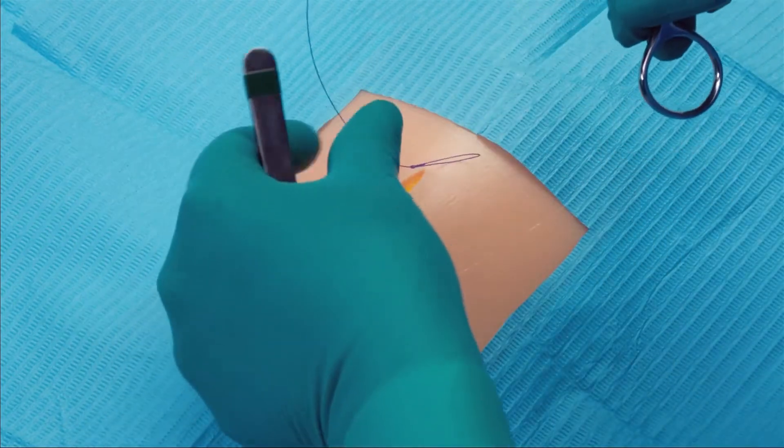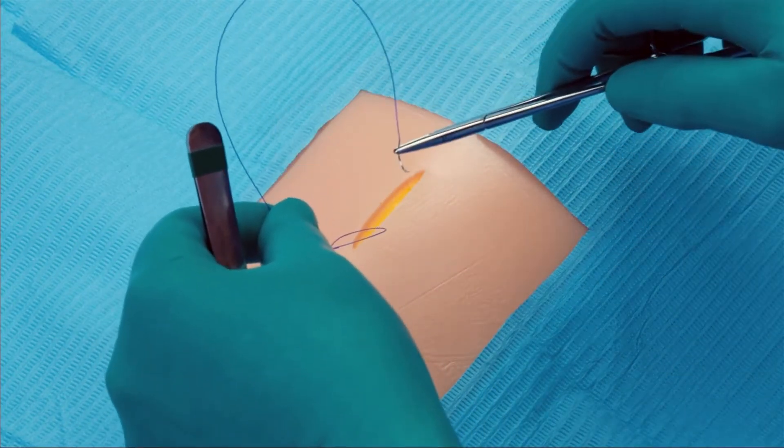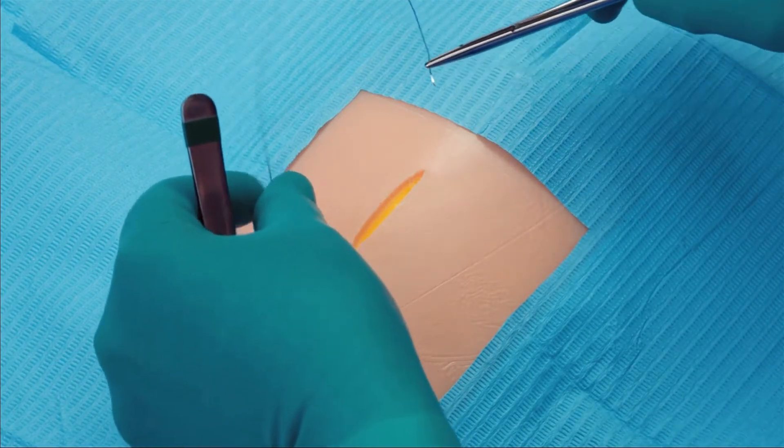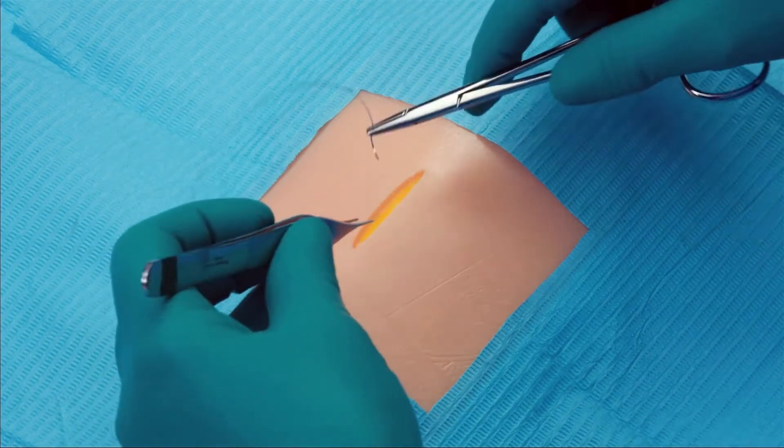So with this suture, I'm going to do a whole layer of deep sutures, and then come back and do a whole layer of superficial sutures.